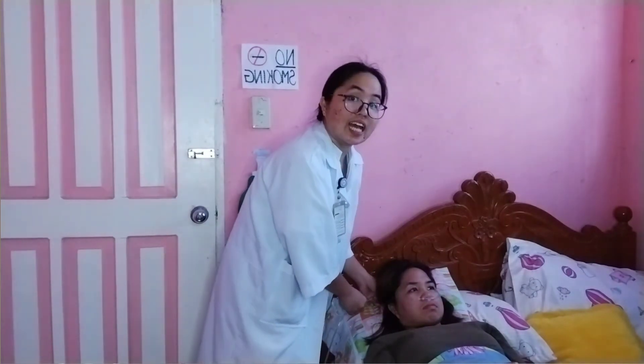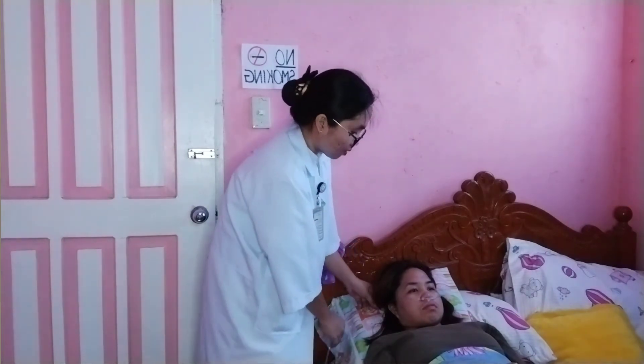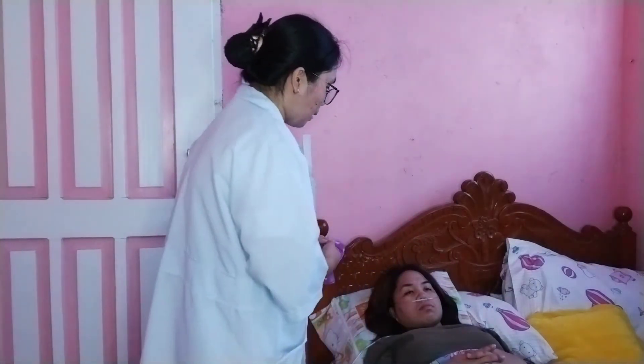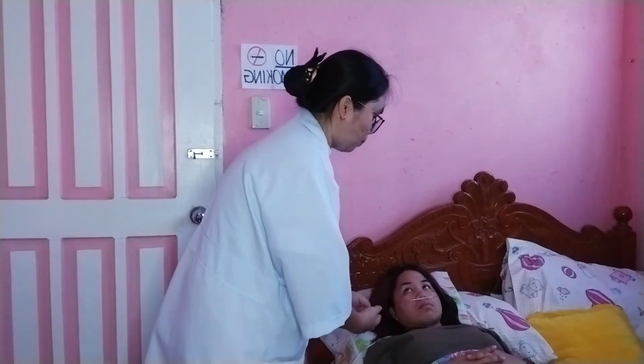Adjust again but not too tight. Ask the patient if the fit is comfortable. Encourage the patient to breathe through the nose with the mouth closed.